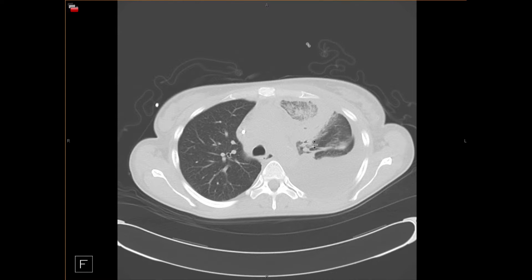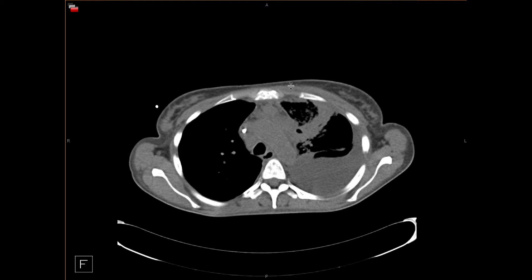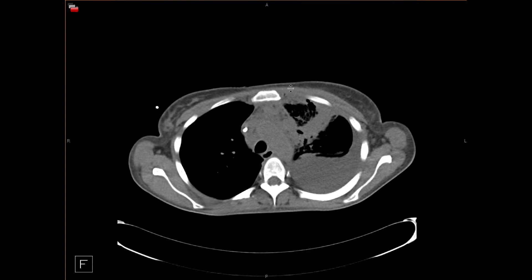Here we have a large area of consolidation in the left upper lobe with central ground glass. In angioinvasive fungal pneumonias, the center of the reverse halo sign tends to be ground glass. This patient also has invasion of the mediastinal fat and the anterior chest wall, which are other features suggesting mucormycosis. It's important to suggest mucormycosis because these patients typically require stronger antimicrobial therapy than patients with aspergillus alone.